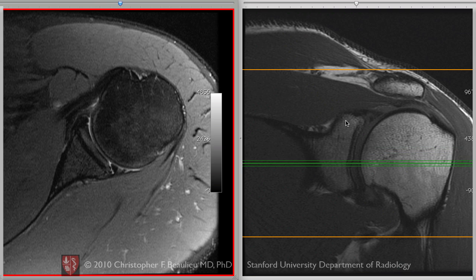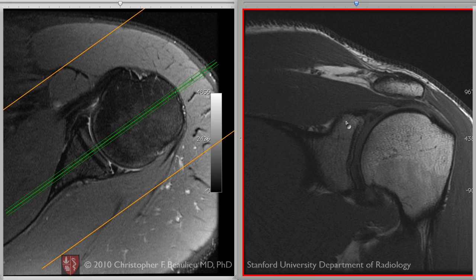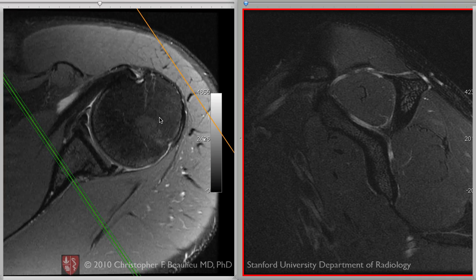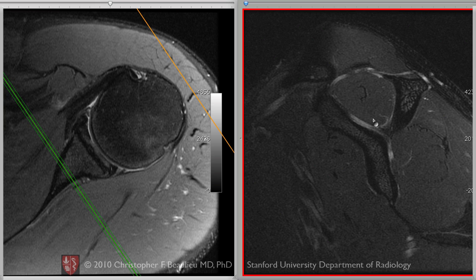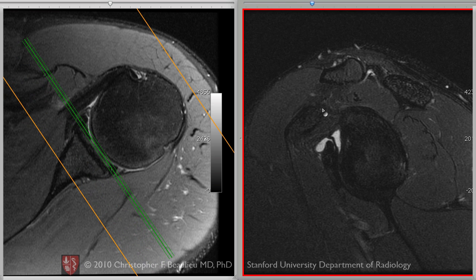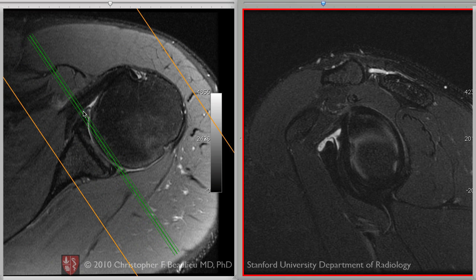I'm going to switch this one to the sagittal image for a minute. Now I've switched to the sagittal orientation here on the right-hand panel, and if we're in the plane that's parallel to the glenoid face, you can see the glenoid itself. This is anterior, posterior, superior, and inferior.